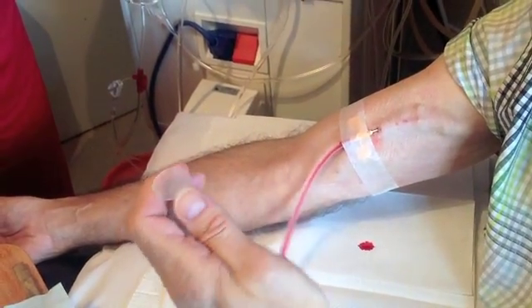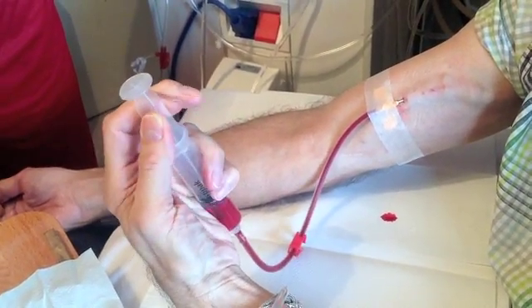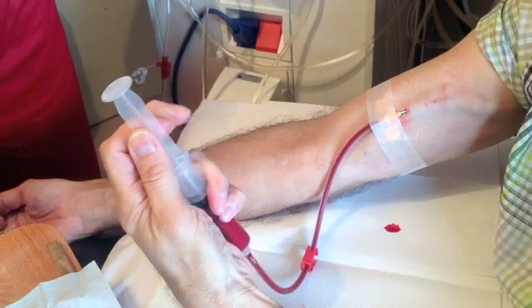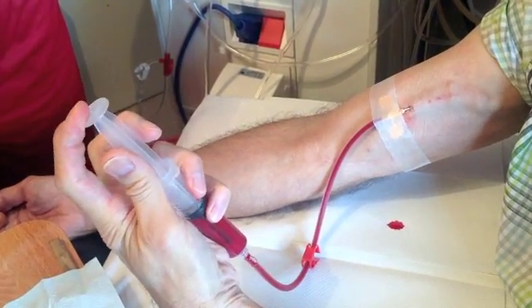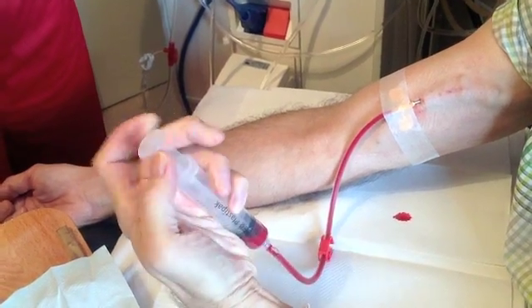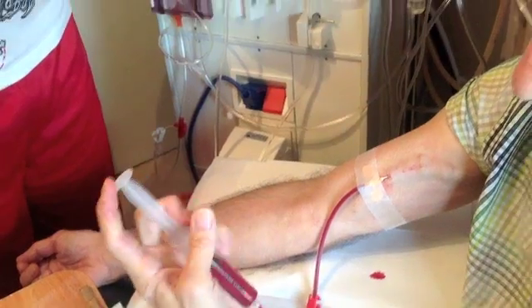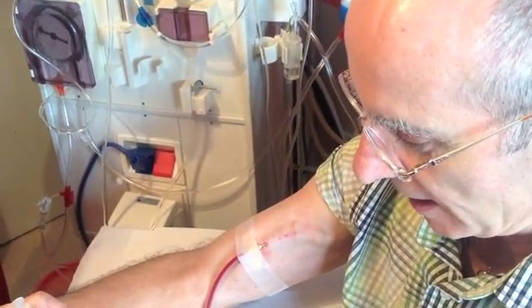Taking the syringe and pulling the top to bring the blood through, and check your flow. Not pushing all the way down because you don't want air in the system. There's a good flow and there's no pain.